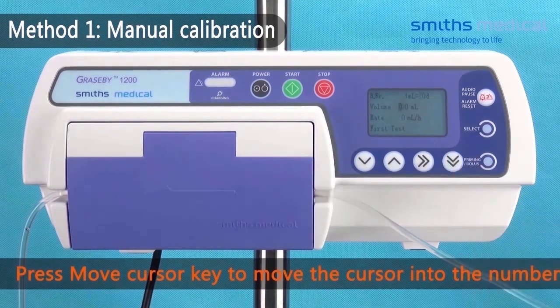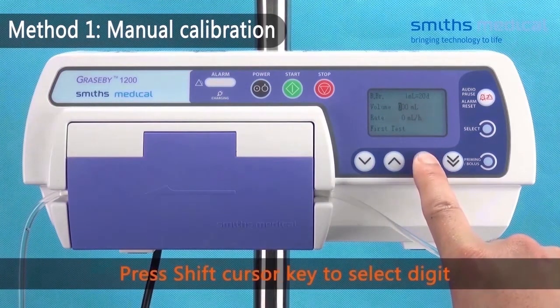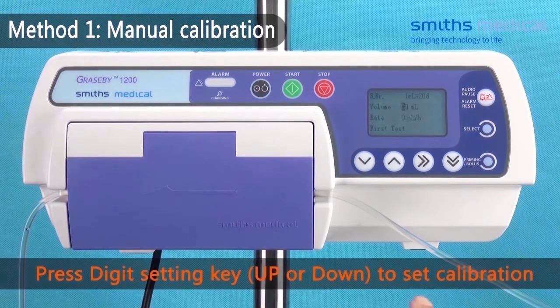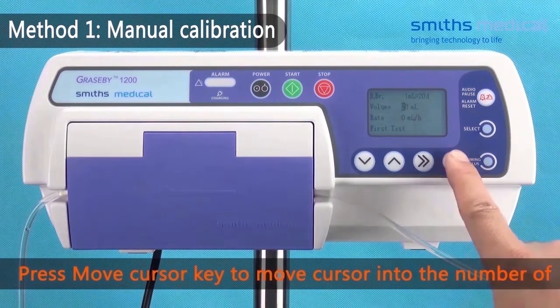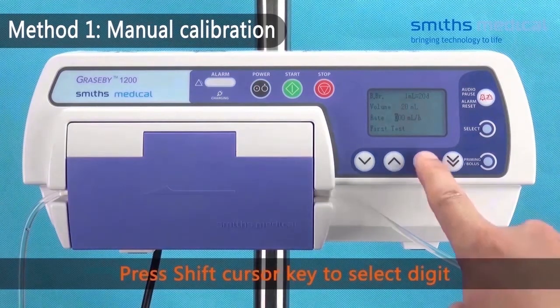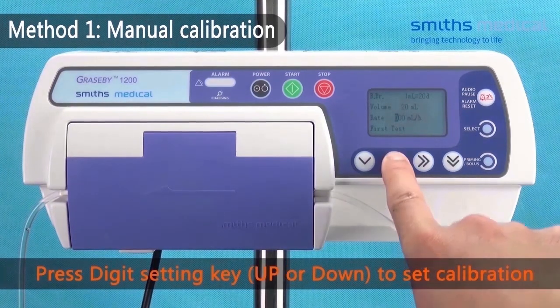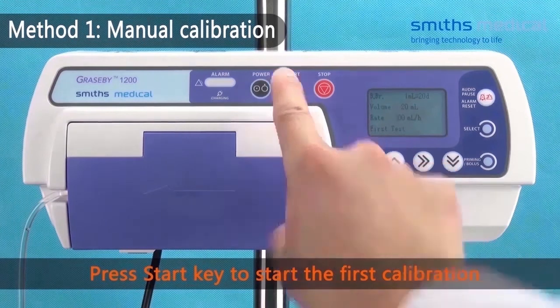Press the move cursor key to move the cursor to the calibration volume number. Press the shift cursor key to select the digit. Press the digit setting key to set the calibration volume to 20 mL. Press the move cursor key to move the cursor to the calibration rate. Press the shift cursor key to select the digit. Press the digit setting key to set the calibration rate to 200 mL per hour. Press the start key to begin the first calibration.